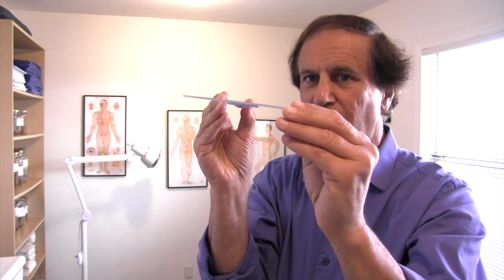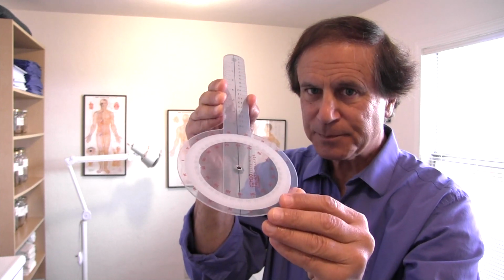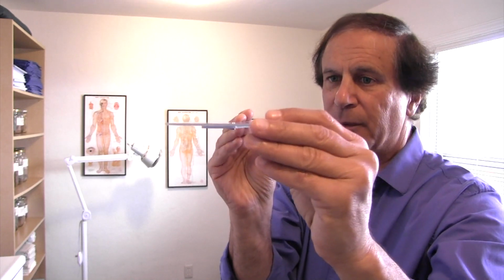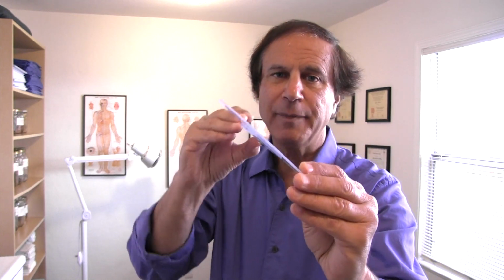So think of a jet aircraft flying along, and it has basically 6 planes of motion it could go through. One is the nose tilts down, which would be flexion. Another is the nose comes up and the back goes down, which in this case would be extension, and the plane could rotate or turn to the right. The plane could rotate or turn to the left. And of course the plane could tilt, in this case laterally flex to one side and laterally flex to another. So those are the basic planes of motion that you're measuring.